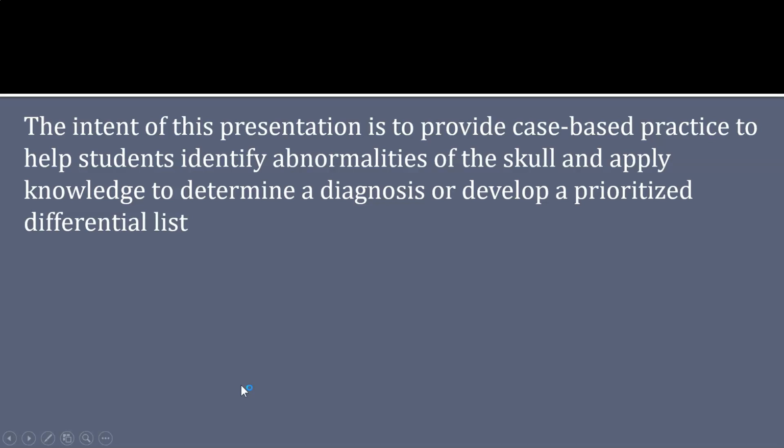Although I'm not going to spend too much time reviewing each study in this presentation, remember that you should be practicing review of studies by using the checklist provided in the initial presentation so that you consistently review the entire image each time until it becomes second nature. Be sure to always practice writing findings being as descriptive as possible using anatomic and radiographic terms before you come to your conclusions.